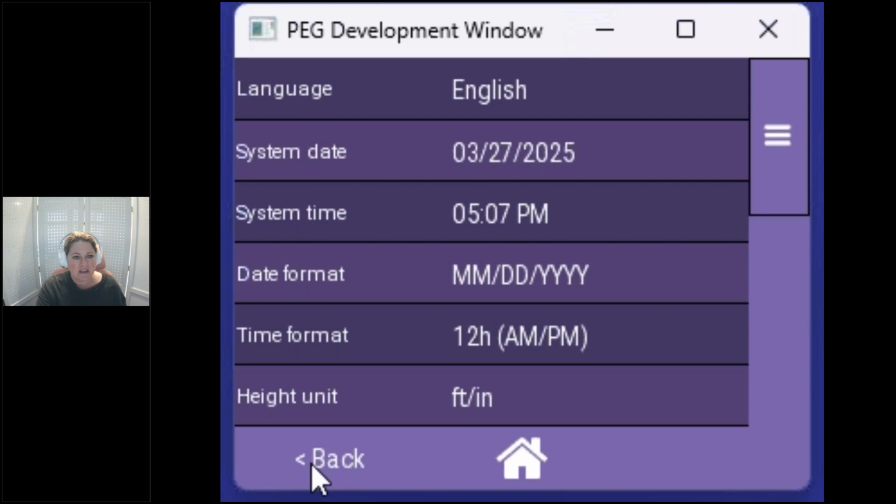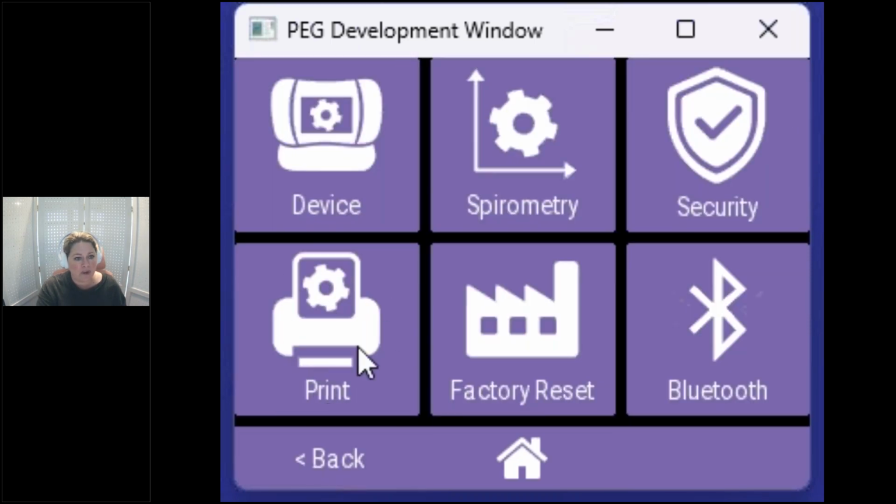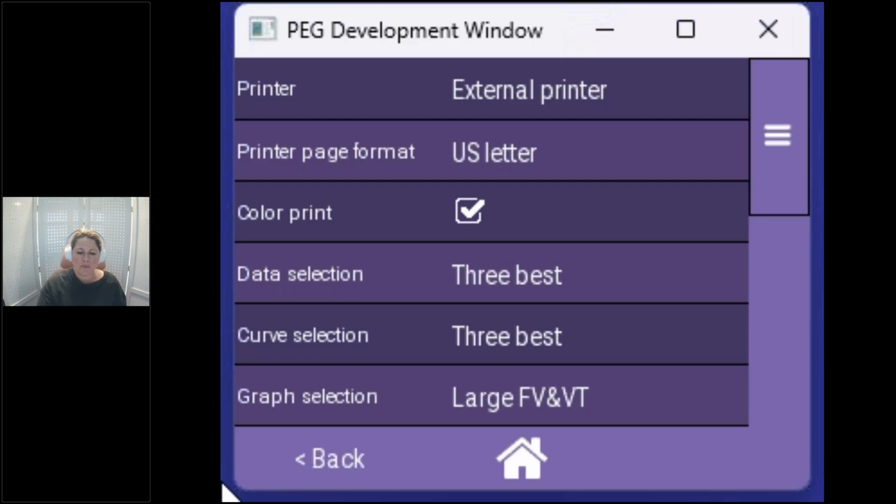All right. Scooting back, I'm going to now go underneath the Print tab. Underneath the Print tab, again, this is applying to if you are printing directly from your EasyOne Air spirometer. If you are syncing to the EasyOne Connect software to save as a PDF, to directly interact with an EMR, or to print more advanced features from the software, these print settings are not the ones that you are going to adjust. You'll actually adjust those in EasyOne Connect. So when we're adjusting printer settings on the Air itself, that is when we dock it, and this is hooked directly to a printer to print that report.